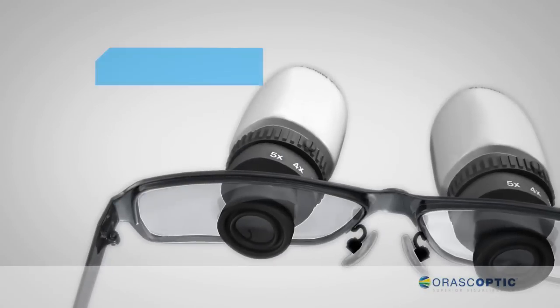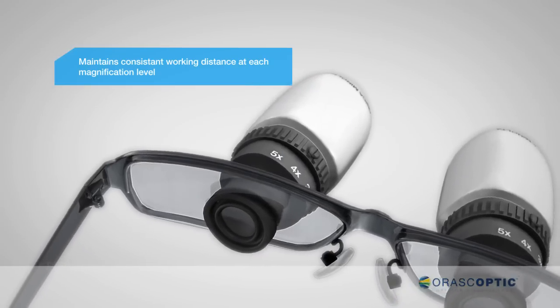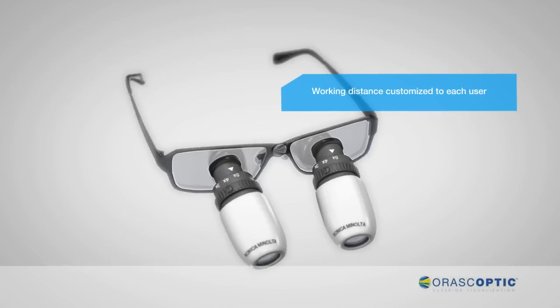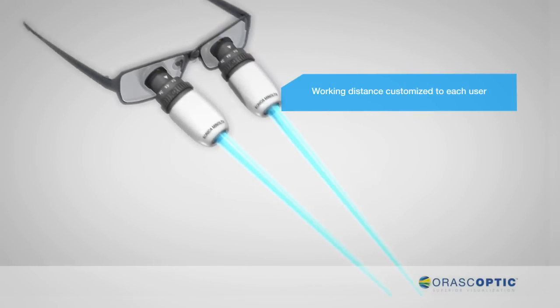As you zoom in and out, the iZoom maintains a consistent working distance at each magnification level. The working distance is custom-tailored to your specific work environment.